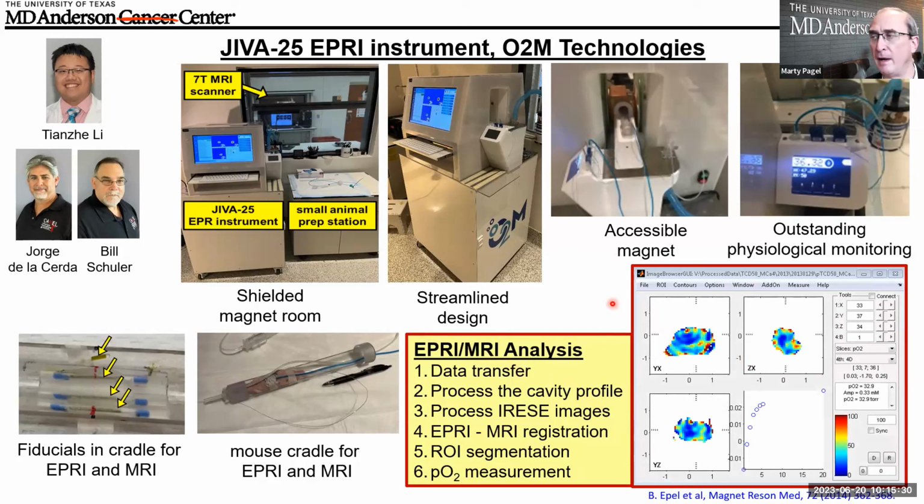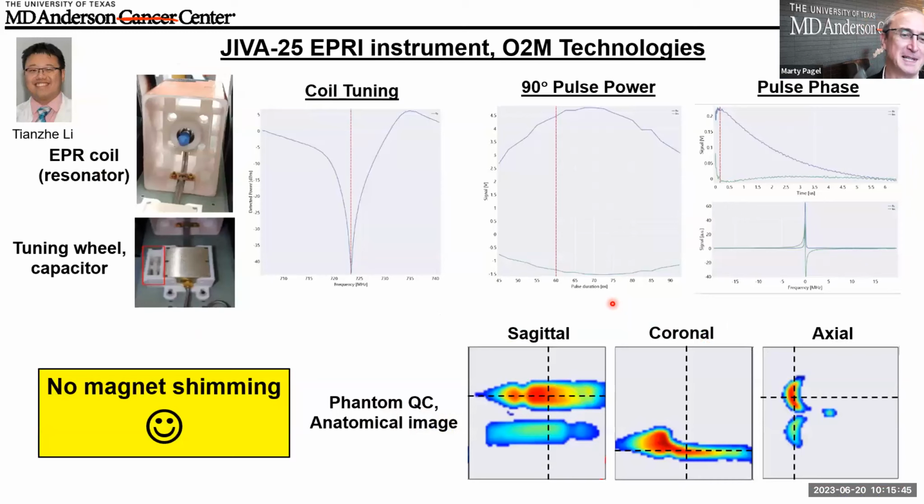It's a bit of an involved process to ensure that the registration is fine. But then after that, the calculation just takes off, no trouble at all. So one trained can do a calculation in about half an hour. For me, it takes about an hour. The students are still training me.